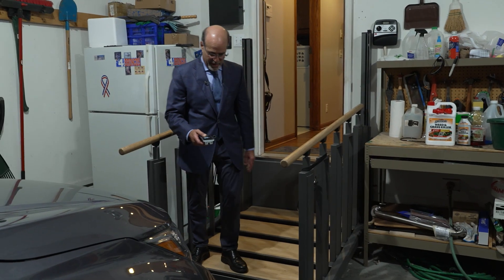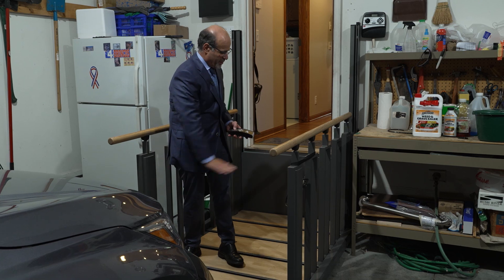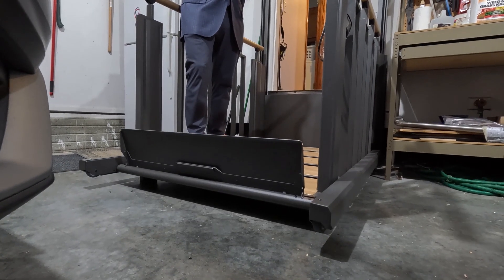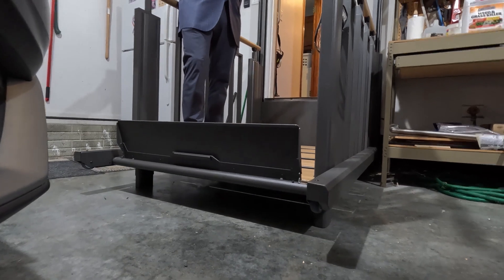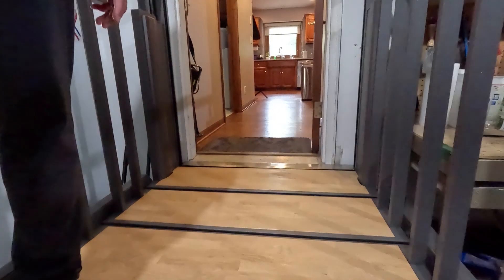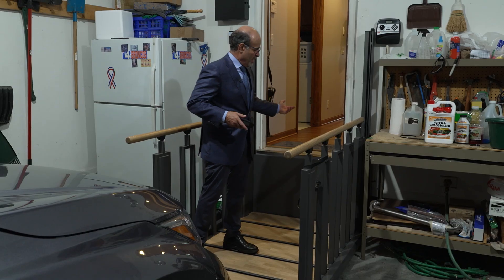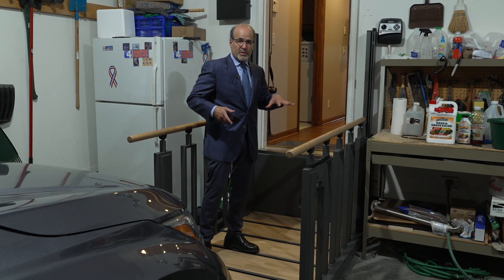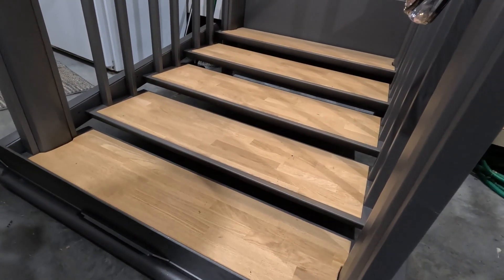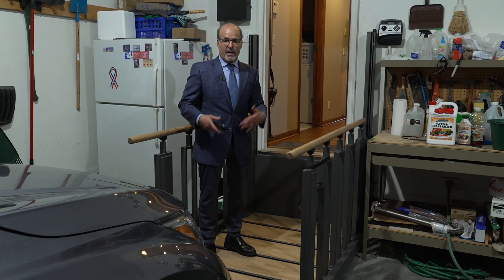So now it's a platform lift. Watch how this works: you bring your wheelchair on here and then have the platform to bring you up in your wheelchair and into your house. And then when you're done using it, it turns back into steps so that anybody can use it, and you have the space savings.